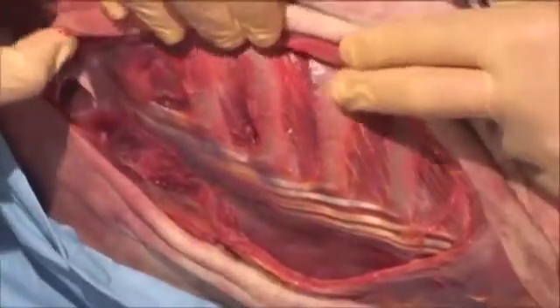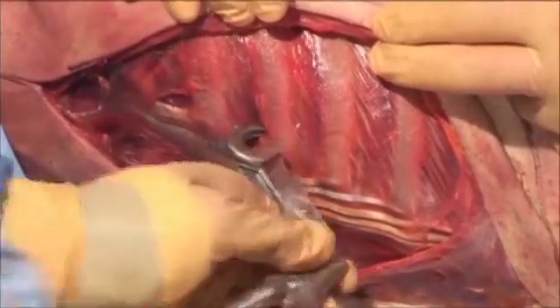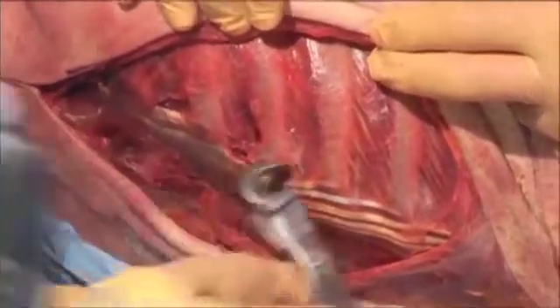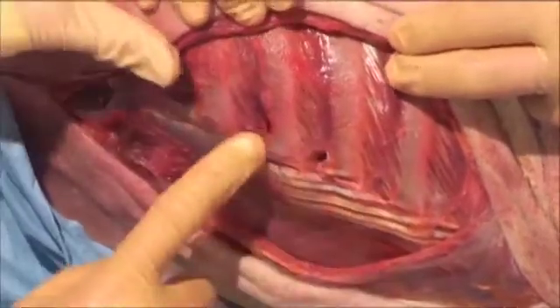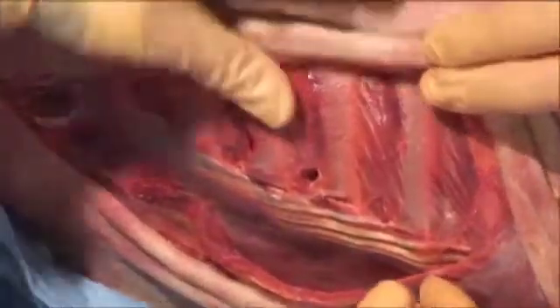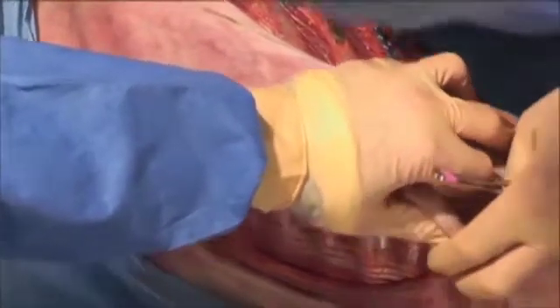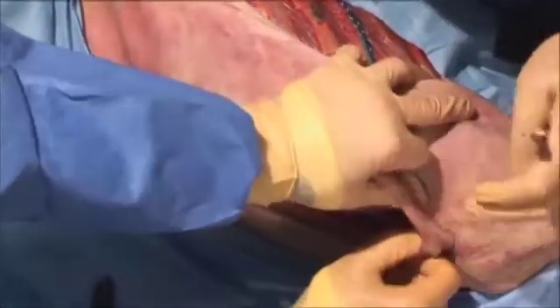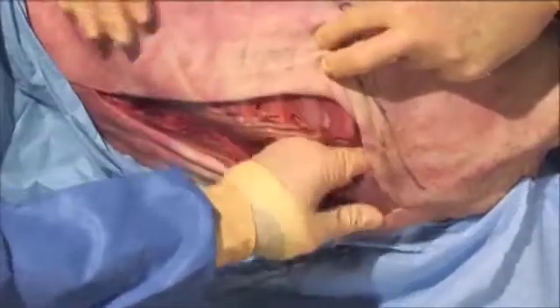So if you have a series of posterior fractures running here, I have easy access to the back of the ribs. Whereas if I was coming from the front, it becomes very difficult to work along there. In here, I have the serratus and latissimus completely preserved, nerve vascular bundle up underneath the scapula. Trapezius here with the rhomboids coming in — I can tease through here to get up as high as I want. I'm touching the first rib right there.